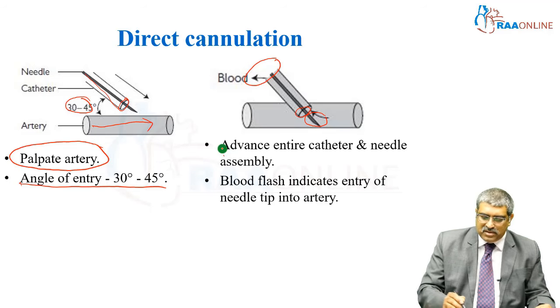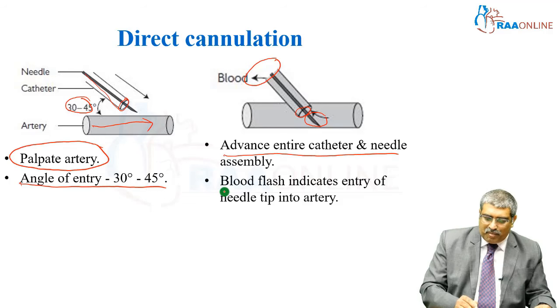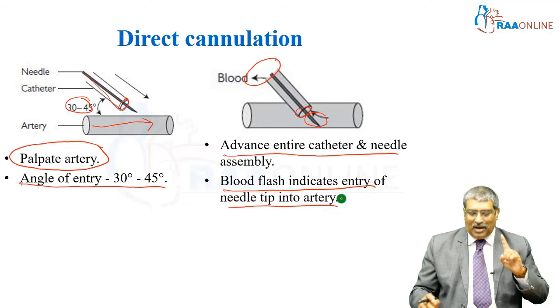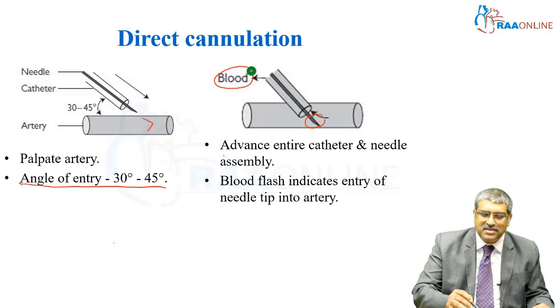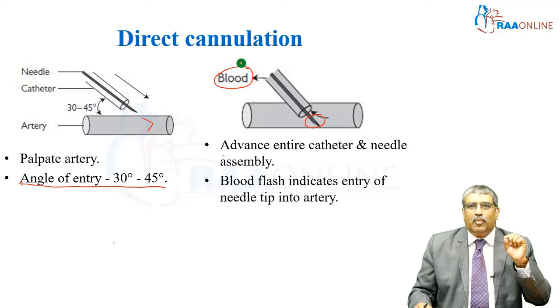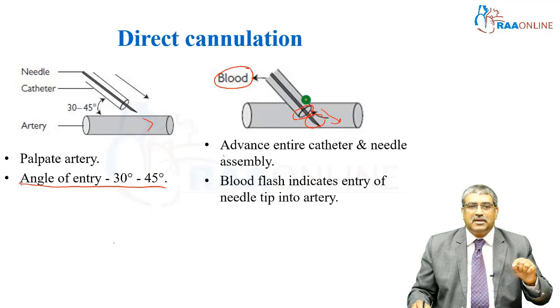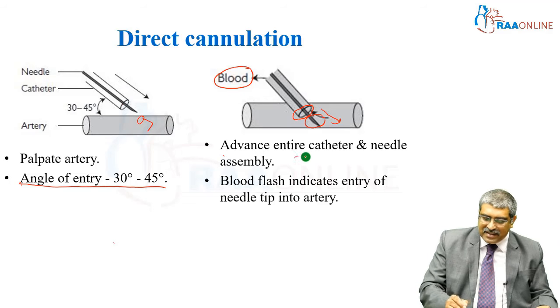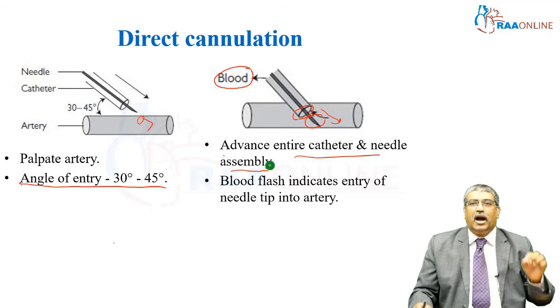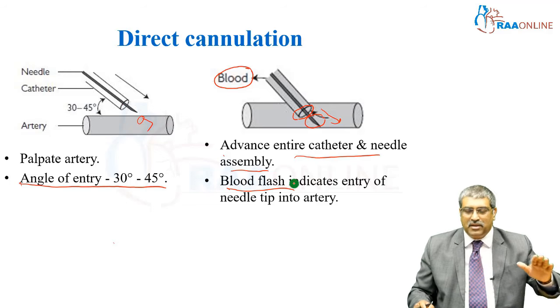Once blood comes, you should not remove the needle — you should advance the catheter and needle a little further. Blood flash indicates the needle tip is in the artery, which is very important. Once the needle is in the lumen, you can see the blood inside the proximal part of the cannula. You have to advance a little further so that the catheter is also inside the lumen. Sometimes only the needle tip is there and you can still see blood, but the catheter is outside the vascular lumen. So you have to advance both the catheter and needle a little bit to confirm blood flash, so that both the needle tip and the cannula are inside the vascular lumen.